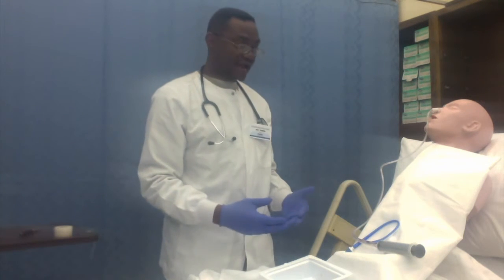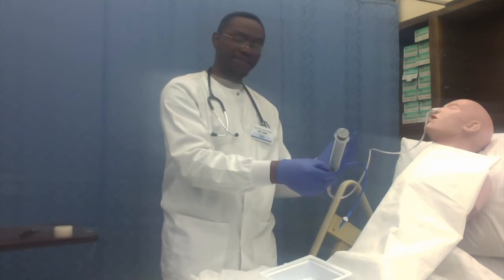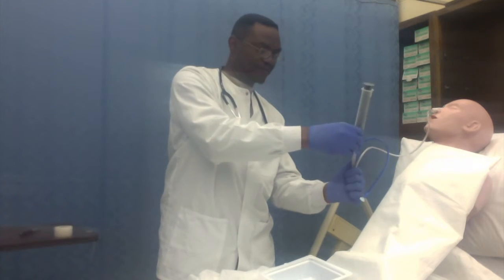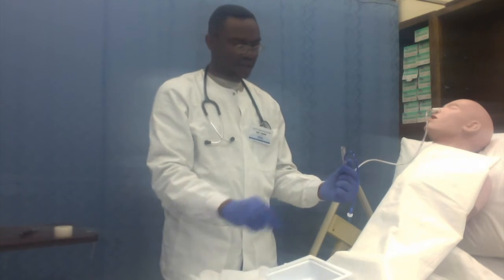When the patient comes back from the X-ray and the placement of this tube is properly confirmed, I will now proceed by hooking my patient up to suction by clamping the tube once more, taking off the syringe and hooking up my tube to suction.